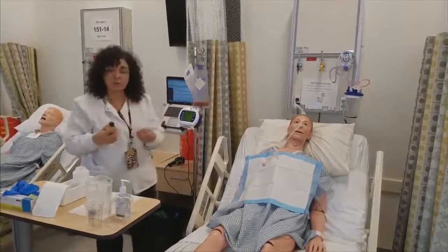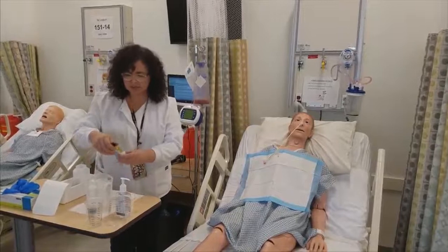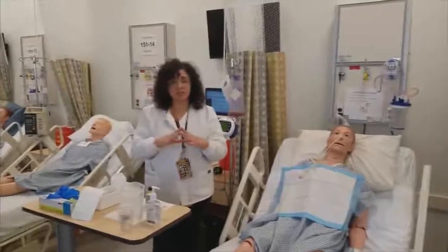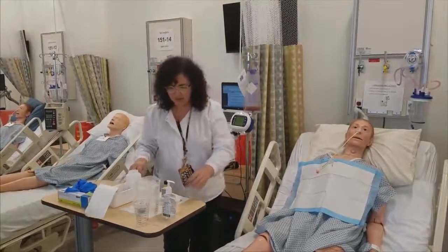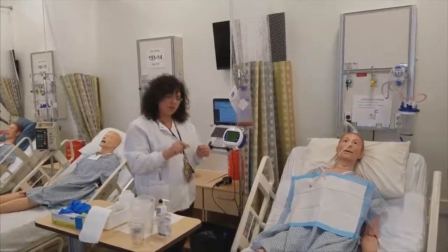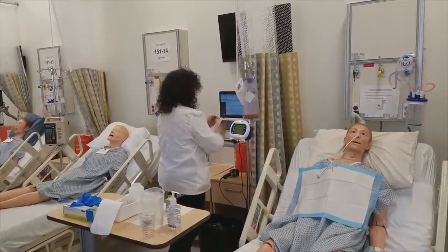I've also done my homework, and I know that my pill can be crushed without a problem. It is not on the do not crush list, and the lactulose is already in liquid form. Also, I need to think about pre-administration assessments such as blood pressure, pulse, those kinds of things, and there are really none that apply here. So then I am going to go ahead and do check number 3. And the reason I have to do all 3 checks before I start prepping is because I need to scan this barcode. So let me just check it again, check number 3.